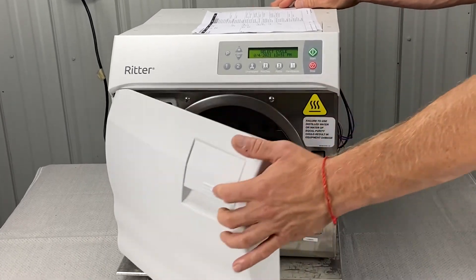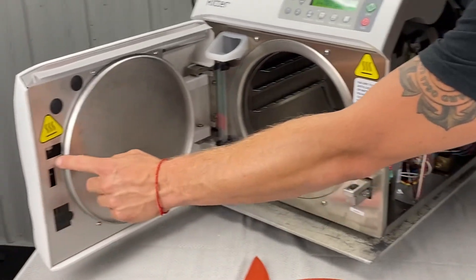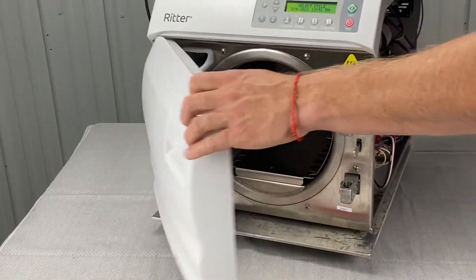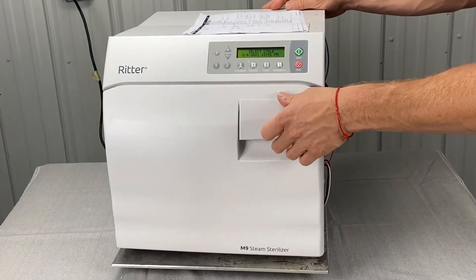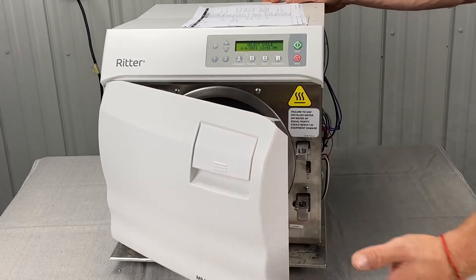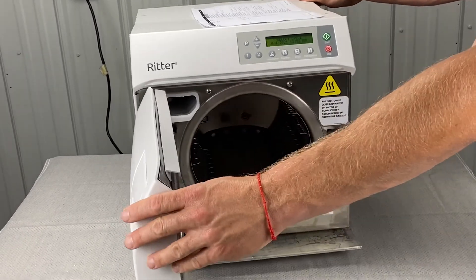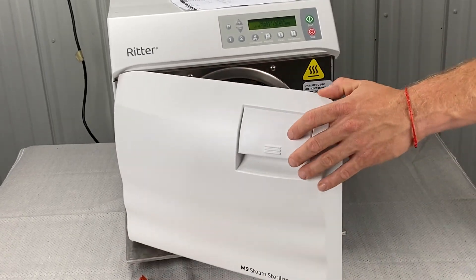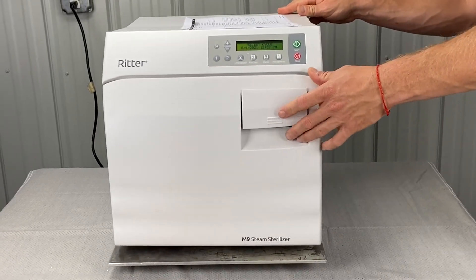It could also be the door pins inside here — they slide in here and get all gooped up. Stuff gets stuck in them: paint chips, whatever falls in there as things crack. You want to make sure this is opening up freely. You might have to take the door off and get in there and clean them up — they get gummed up. Refer to the other video on how to take the door cover off and clean that area.